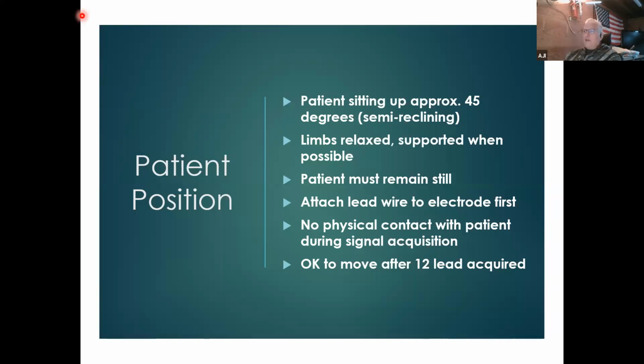And then obviously we're going to attach the lead wire to the electrode first before we put them on there, because you'll be pushing into the patient. The electrodes, the sticky portion, attach the lead wires, set it up. And while this is running, no physical contact with the patient during signal acquisition. The patient's quietly sitting there, nothing's moving. And then after the 12 lead has acquired, the patient can move around, they can talk, they can do whatever. So this is something you have to be sitting still for, not driving down the road.